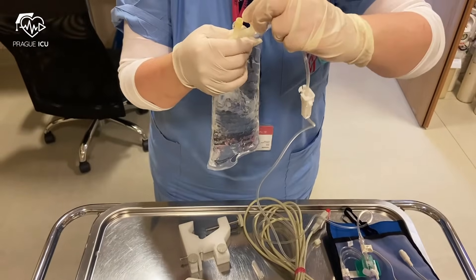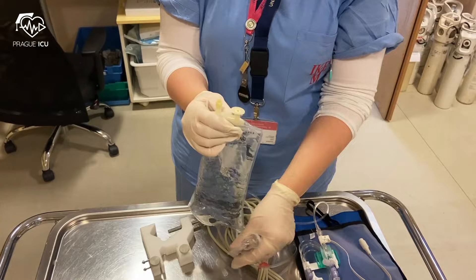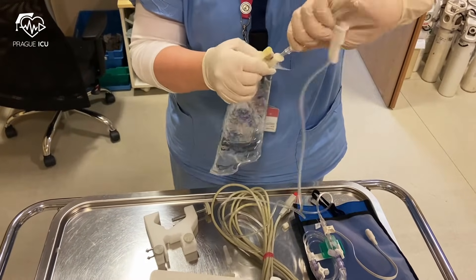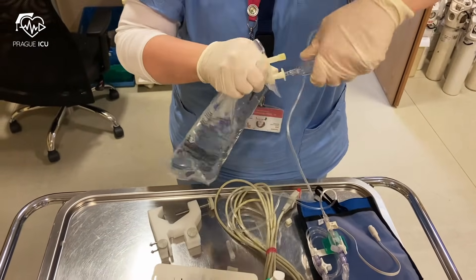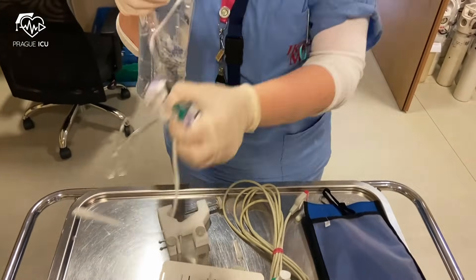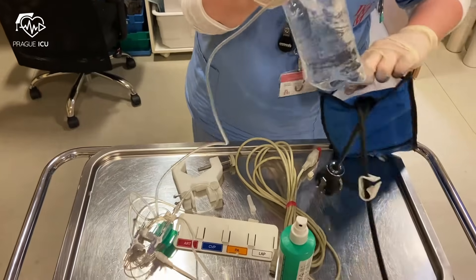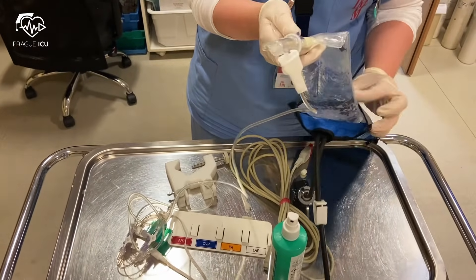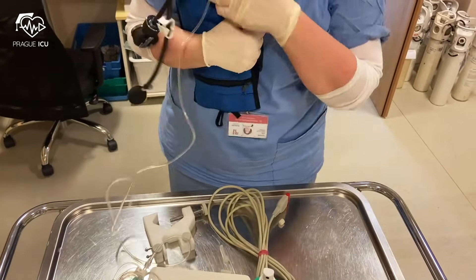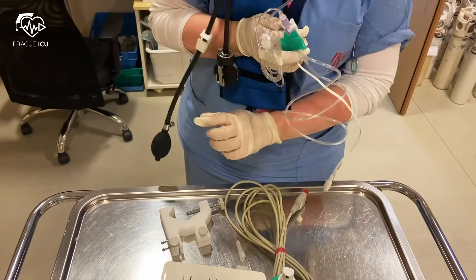Then you spike the bag with tubing and put it into the pressure bag, and inflate it to 300 mmHg to sufficiently counteract the systemic pressure.